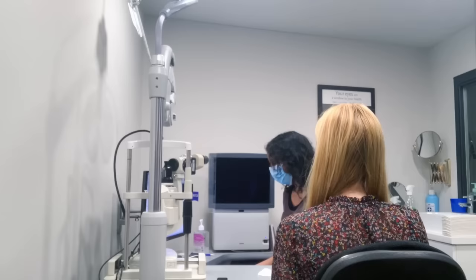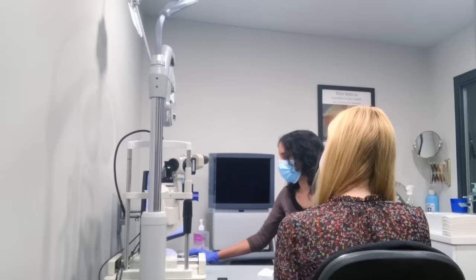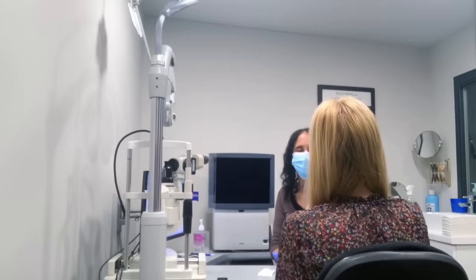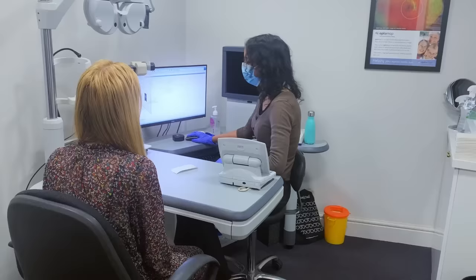So is it just a routine sight test as far as you're concerned? Yes, a general health checkup kind of. Sure. So have you ever had any need to go to the doctor or the hospital concerning your eyes in the past? I think when I was a lot younger, one time for conjunctivitis. Okay, fine. And are you on any regular medication? No. Okay, great.